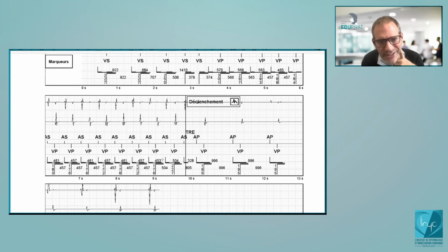And you see that the atrial cycle was 450 milliseconds. And if you prolong the AV delay, you also delay the occurrence of the atrial signal. So this is a PMT, and it's not a question of prolongation of PVARP. With the diagnosis of PMT, you will not synchronize ventricular pacing on this cycle. So it's AS, but without ventricular pacing. What the device will do then is pace the atrium and the ventricle after 330 milliseconds, okay?